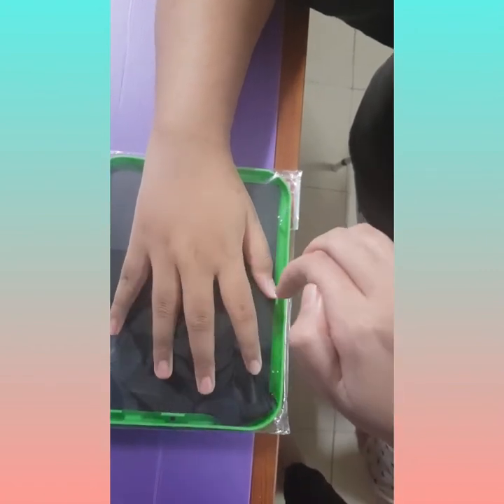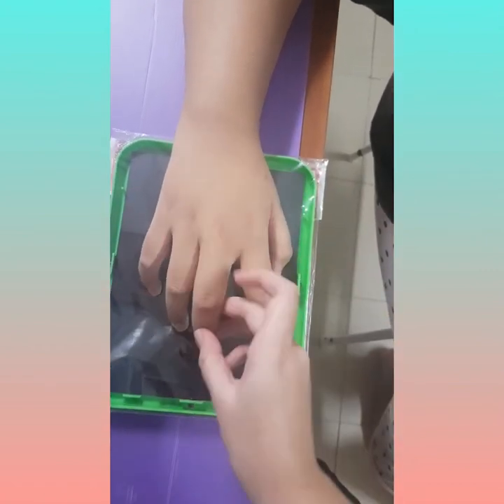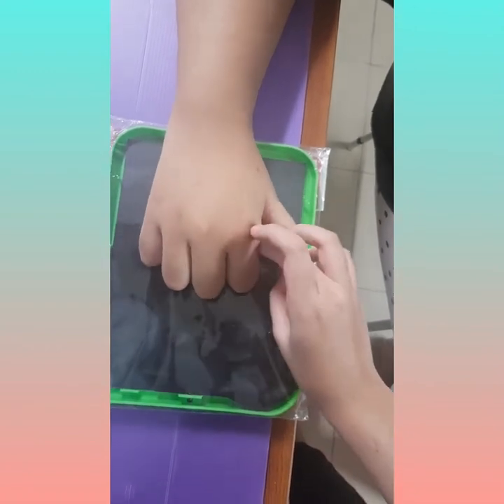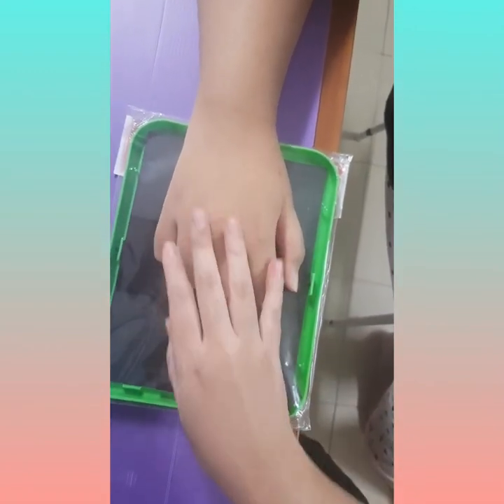Can you flex your hand like this? Just the hand — close it. Yes, there you go. Flex it.